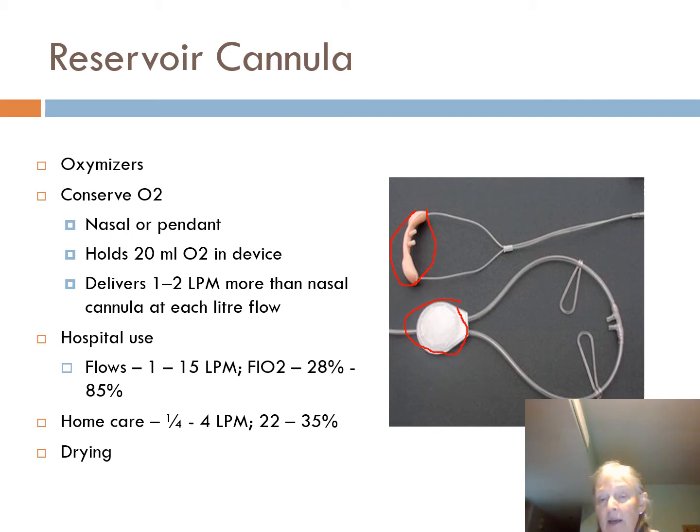They are drying, and people are going to tell you, you got to put a humidifier with them. No, you do not use a humidifier with these, because what happens is that you've got some of this small bore tubing, and as the humidity is coming out of the humidifier, it'll sometimes come down here, go down through the parts of the cannula and get into these areas.